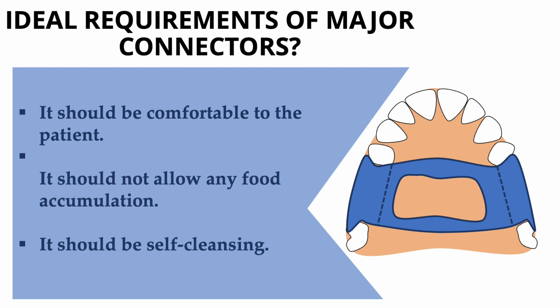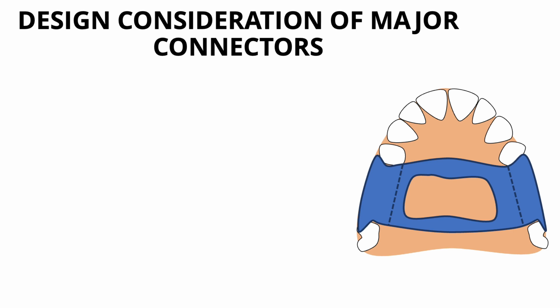Very important. If it does not fit the surface of the palate, it will allow the accumulation of food. So it is very important that it should not allow any food accumulation, otherwise it will cause halitosis, foul smell from the mouth, food lodgement, and caries in the remaining dentition. And it should be self cleansing. This part is very important.